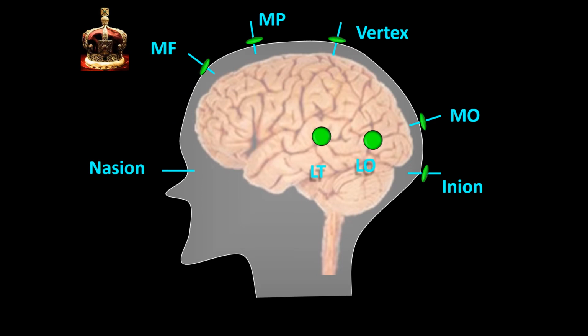Next, we place electrodes at all these locations as I have done in this frame. Notice that it includes an electrode at the inion. Electrodes are also placed at the ear lobes or the mastoid, and they are labeled A1 for the left and A2 for the right.